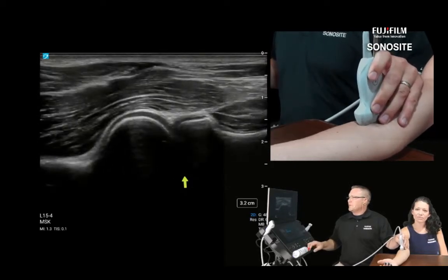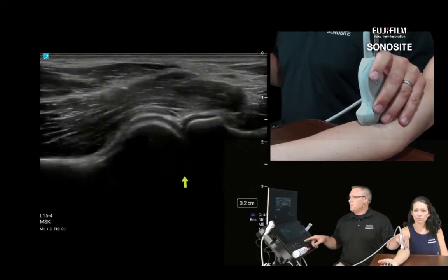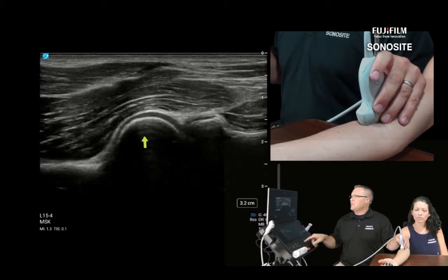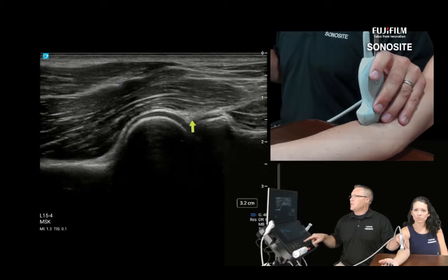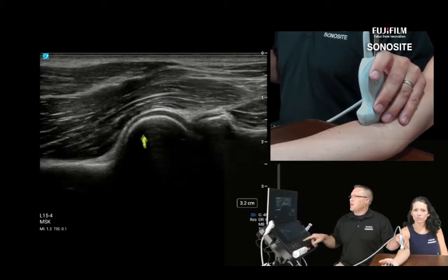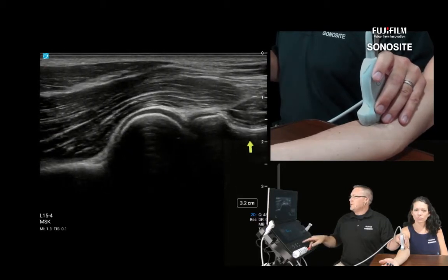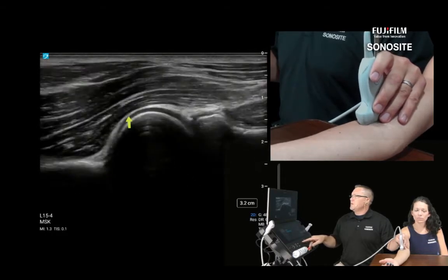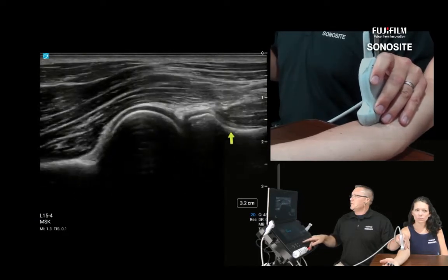If you're showing a patient, or somebody that's learning ultrasound for the first time, especially musculoskeletal, what we're looking at here on the screen, this is an easy window to see things like bone, bony surfaces, a joint coming together, and pretty obvious muscle striations. So this is a great window just to start an elbow exam for anybody that's learning. Distally, we do have the radius, the radial neck, head, distal humeral capitellum here. Proximal to that, we have the radial fossa and the annular recess here distally.